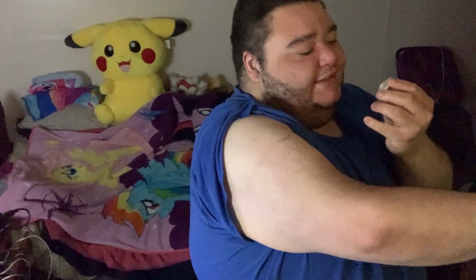All right, so that is off. Now it looks like this. Say goodbye to the old sensor, and I'm going to put in a new sensor soon. And hopefully you guys will understand that. I'm sorry if it looks so grody in that area, but I'm going to clean my arm off and put the new sensor on the new part. So hopefully you guys will see that for sure. And again, I'm sorry if I gross you out. I don't mean to, but that's how it is when you change the Dexcom G7 sensor.